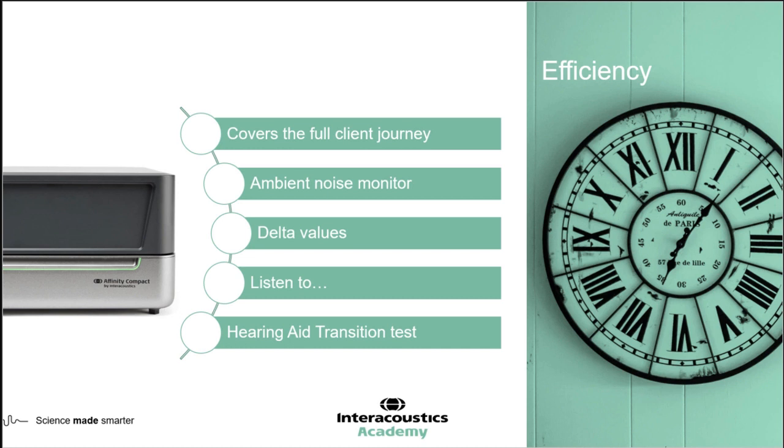But also for home visits, domiciliary visits, or going out into the field where you maybe don't have a typical test booth or soundproofing features around you. Complex or complicated hearing losses often have other complexities which might restrict their ability to come to a clinic and come to a hospital. If we're then offering home visits, it's really nice to see a feature that ensures accuracy in that environment, rather than limiting them in terms of the audiological care that they receive.